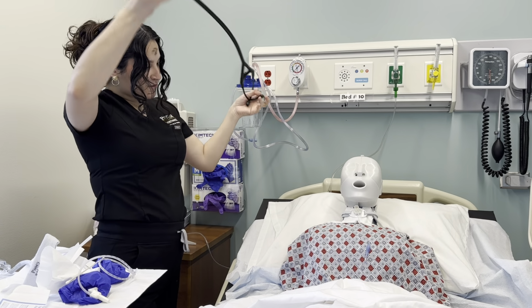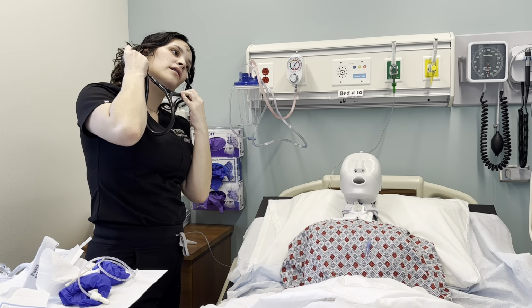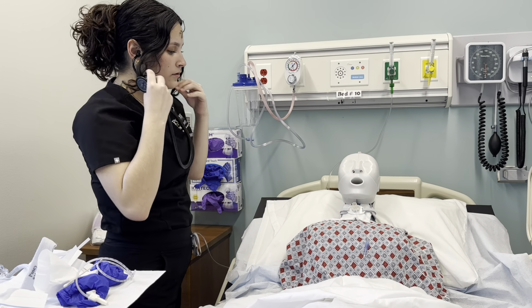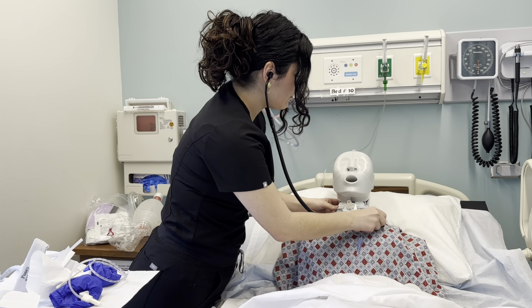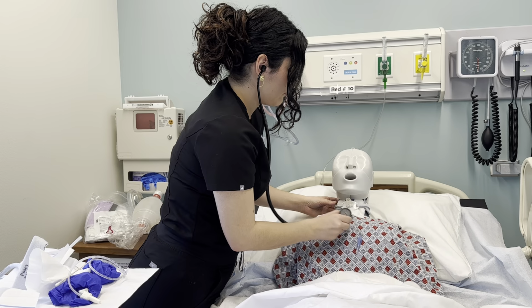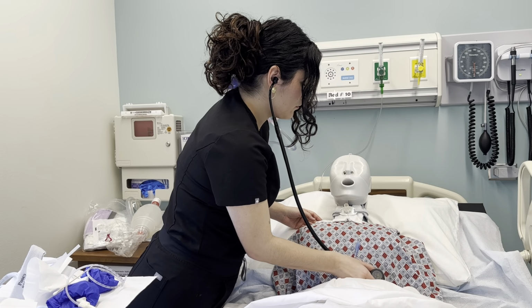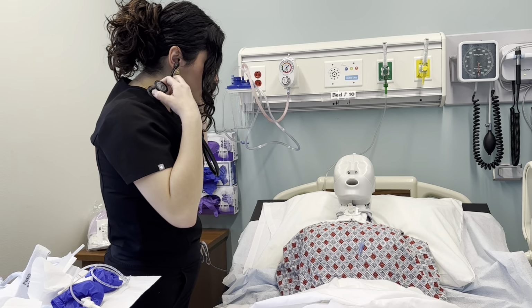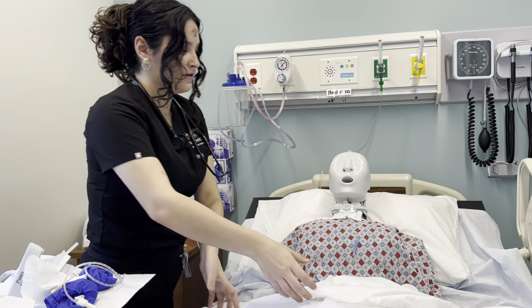Right before that, I will auscultate one more time to make sure of the placement of the new trach. Go ahead and take a deep breath. Okay, sounds good. And now I can put my patient into a comfortable position.